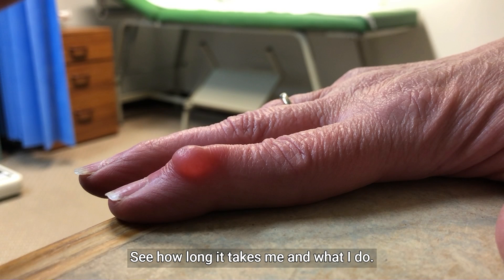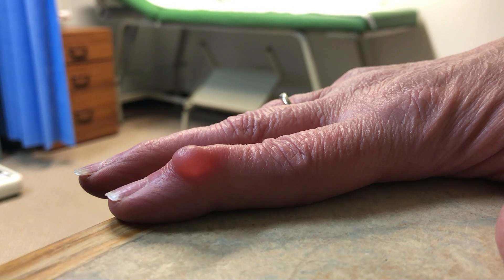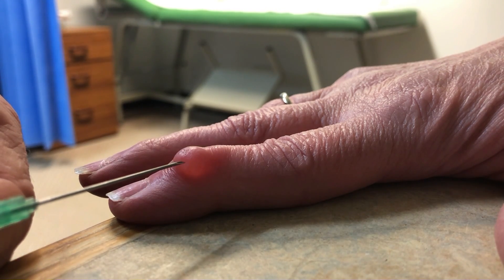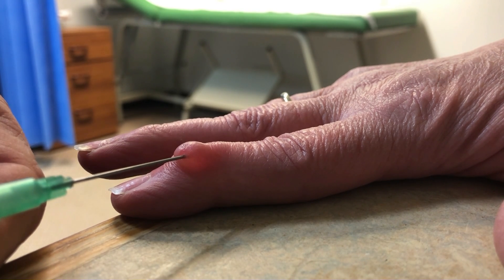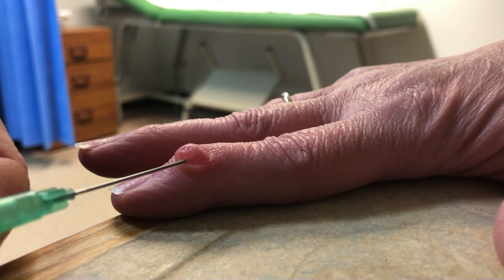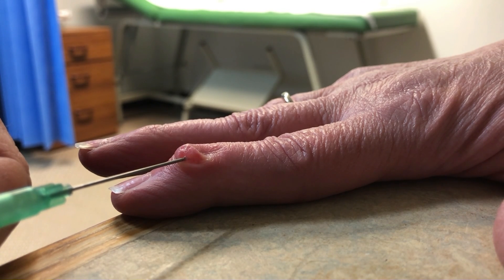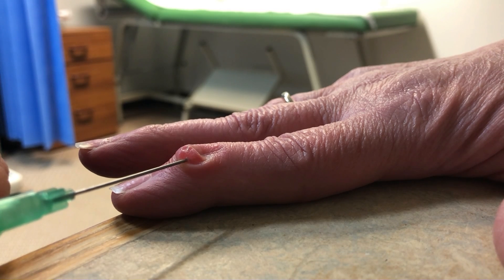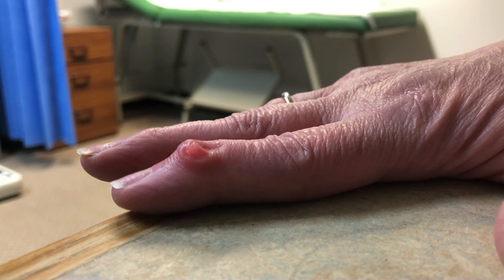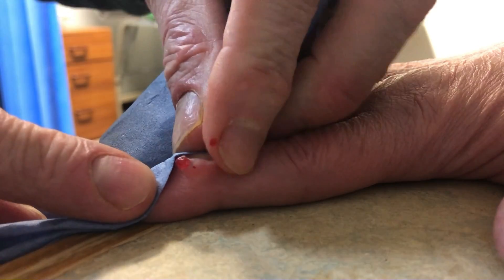I'm now going to give the unedited version of that video — see how long it takes me. Put in the comment section the one thing I tell you to do that I don't do in this video. In the unedited clip, the patient is warned of a sharp scratch, kept nice and still, and the gel contents are expressed from the ganglion.